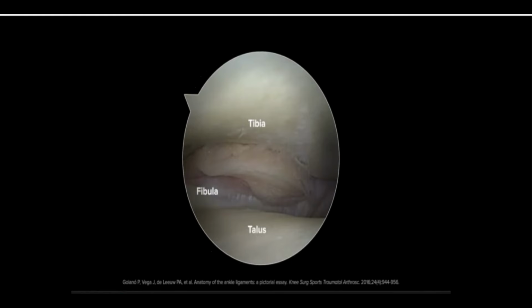It is also worth noting the fatty synovial fringe, which is a small bundle of adipose tissue distal to the insertion site of the interosseous ligament. It retracts and descends and can cause soft tissue impingement during dorsiflexion and plantar flexion, and can be involved in posterior soft tissue impingement syndrome of the ankle.